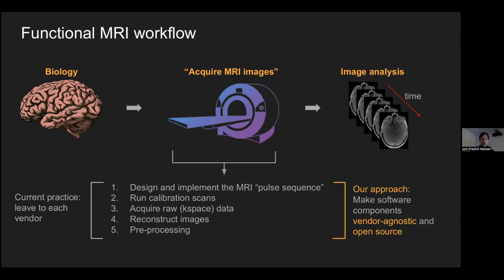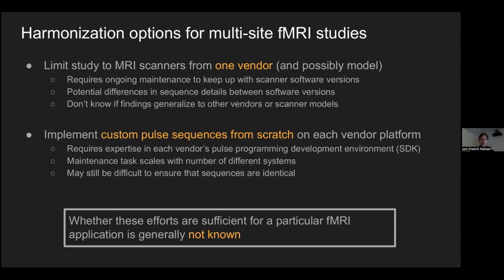It's nothing more or less than essentially opening up that acquisition and image reconstruction process and making sure that how the data is acquired and reconstructed is transparent. And so we're making this tool available, and hopefully the community will contribute back to optimize this further. So that's the big picture.